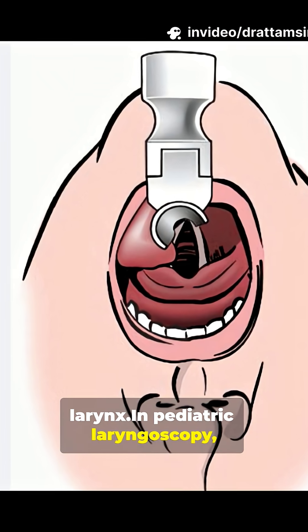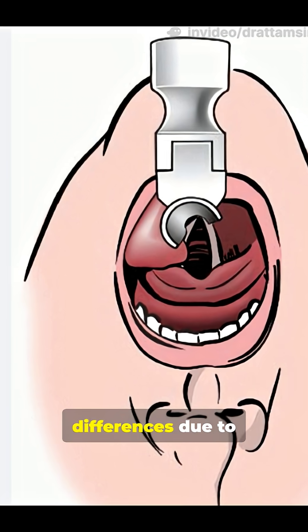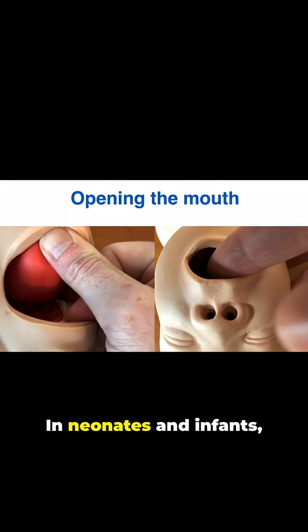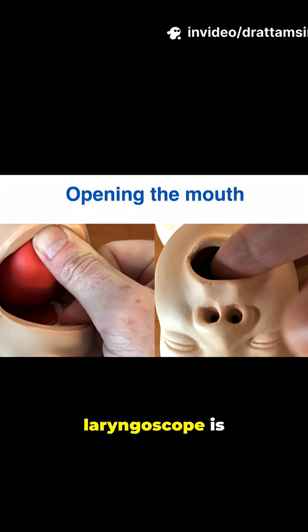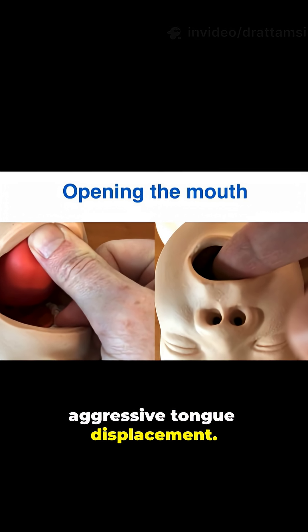In pediatric laryngoscopy, the tongue is also displaced, but with some technique differences due to anatomical variations. In neonates and infants, the mouth is often opened by placing a finger on top of the tongue, and the laryngoscope is inserted carefully, sometimes with less aggressive tongue displacement.